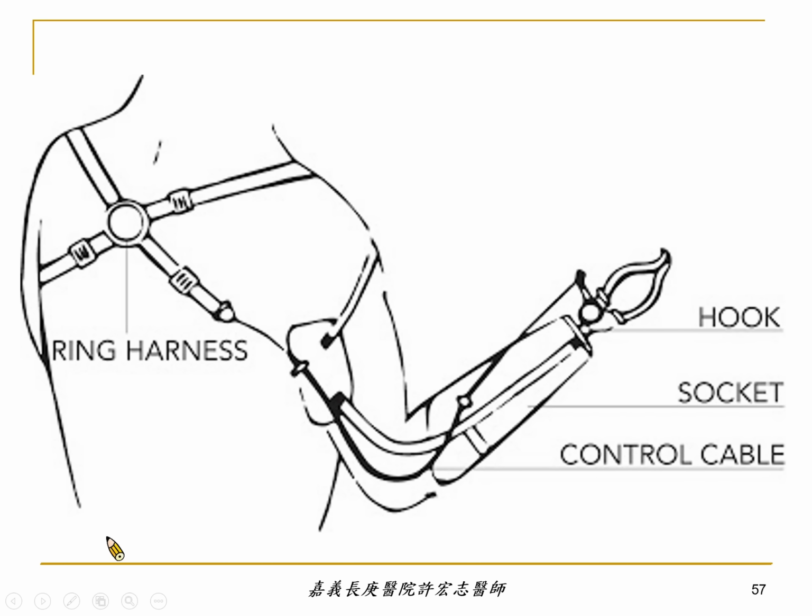How do we fit the upper limb prosthesis to our body? You can wear it like putting on a backpack like this one. If there is a ring in the harness, we call that a ring harness. If you are wearing the upper limb prosthesis this way, how do we use the terminal device?